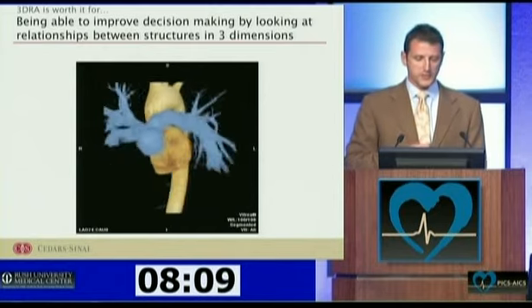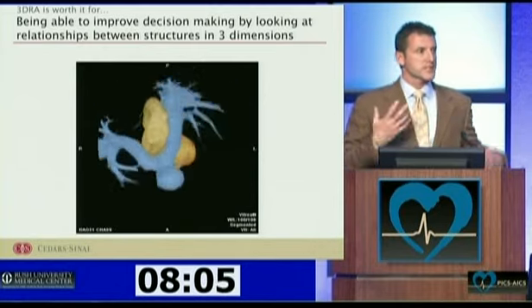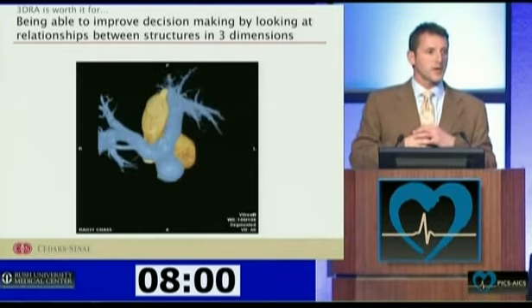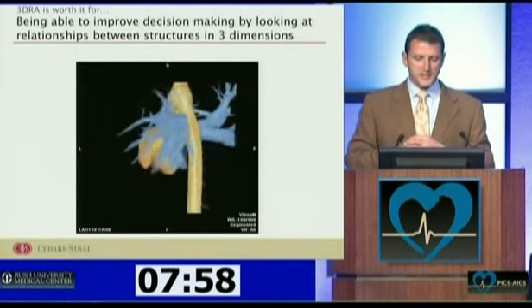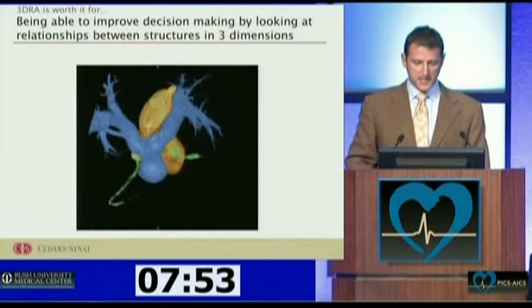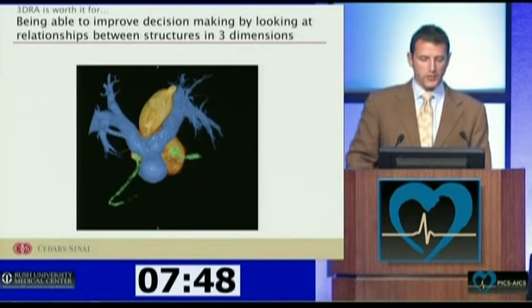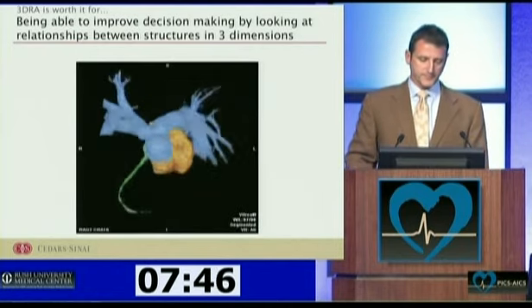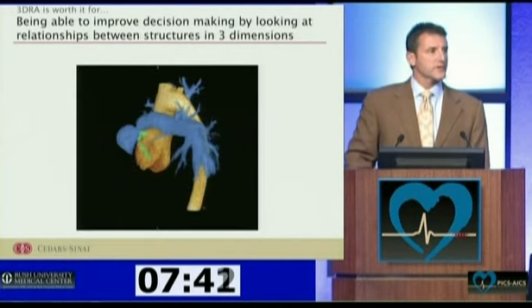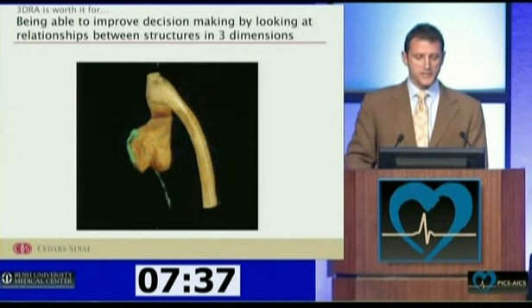This is a patient who had an arterial switch many years ago and has somewhat complex supravalvar pulmonary artery stenosis. Again, we all treat this differently, but one of the ways we like to treat this is with bilateral proximal PA stents. But we looked at this 3D RA, and I began to be concerned not only what impact that would have on the ascending aorta, but also on the coronary arteries, which filled, and particularly the right coronary artery under that right pulmonary artery. And as you've heard tonight, segmenting, making packets of images, you're able to take away and subtract things.